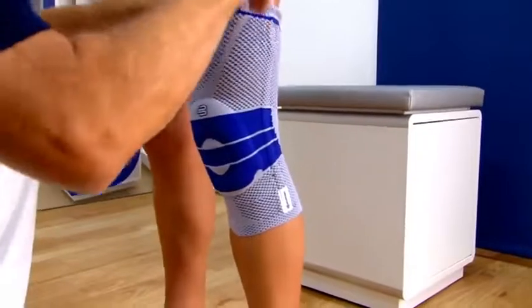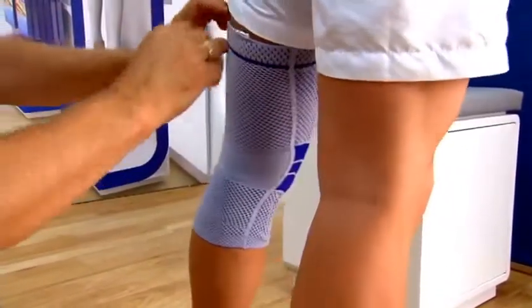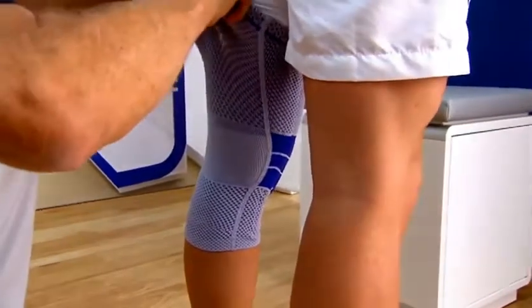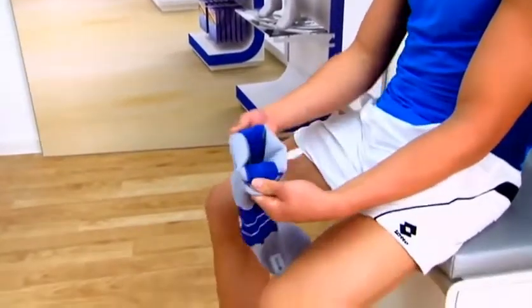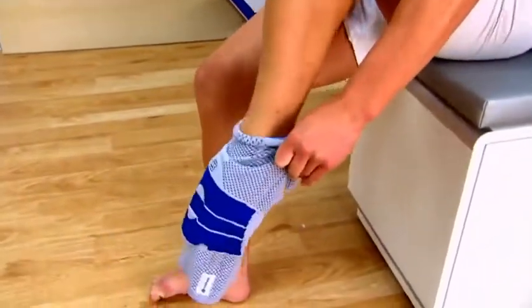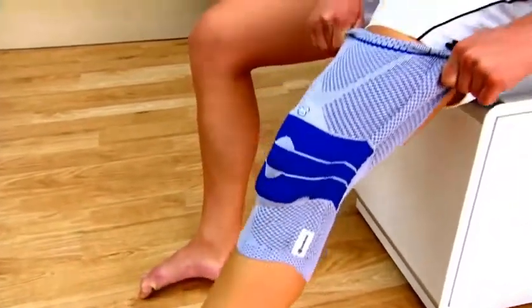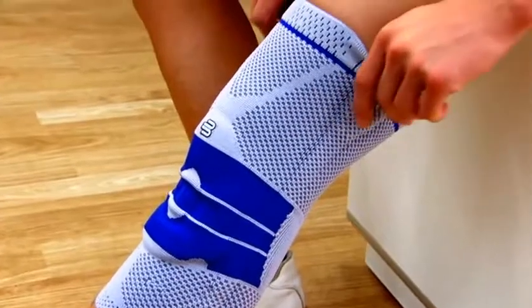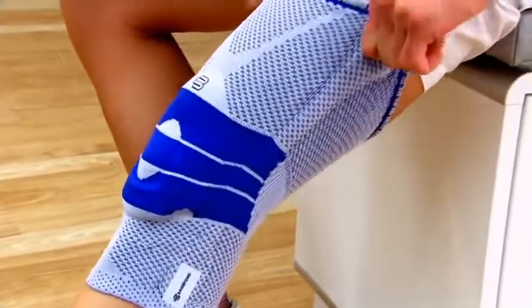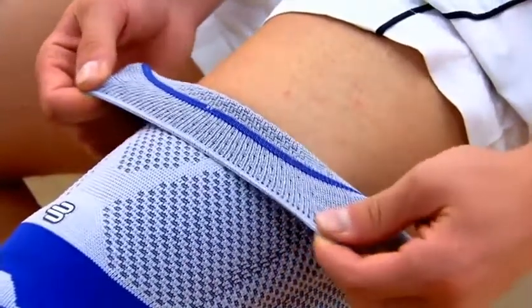Check that the support fits without any creases. In future, the patient can put on and take off the Genutrain correctly. Pull the Genutrain upward with the knee slightly bent, and steadily pull on the donning aids. The gentle phasing out of the compression effect at the highly elastic edges increases wearing comfort.